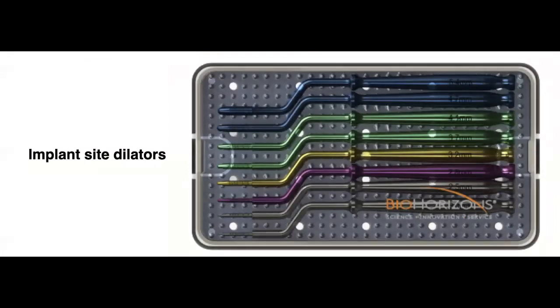These are just an example of site dilators. There's many out there in the market. These are just the ones that I use, but there are many others. So if you use a different brand, that's totally fine. The idea of these site dilators, again, is just to expand or also densify the bone in that site prior to placing an implant, so that we can expand and achieve a little more buccolingual width for that site.